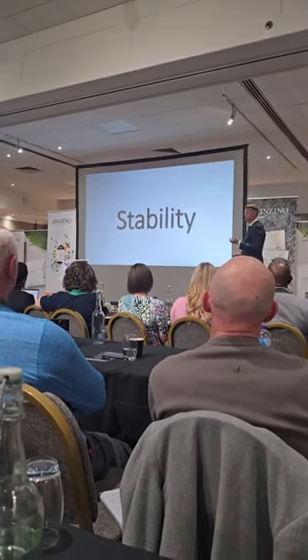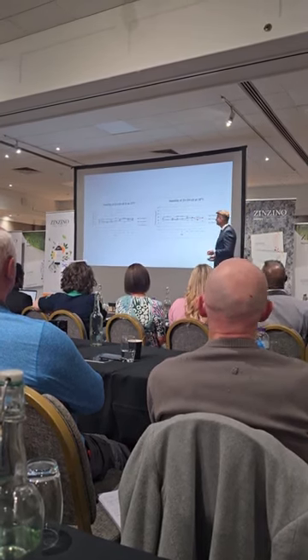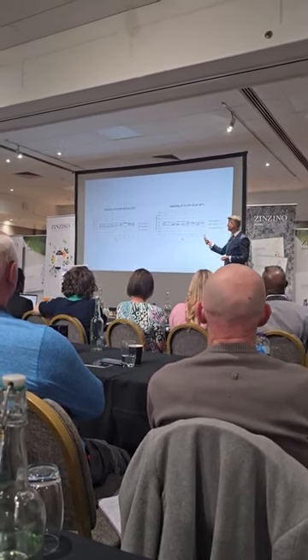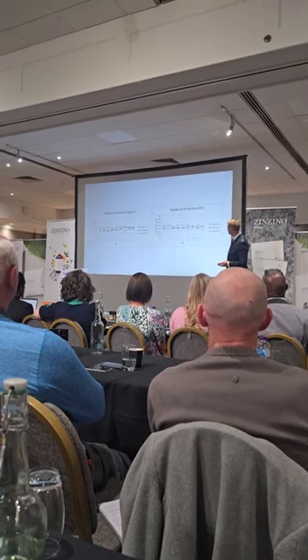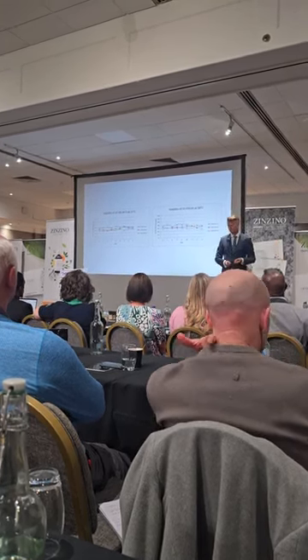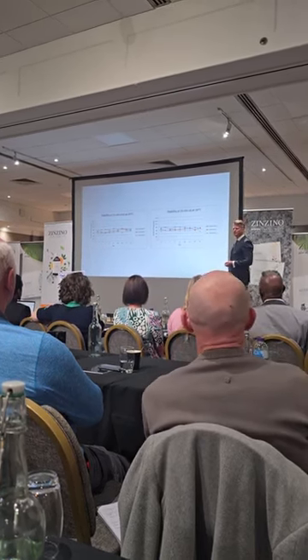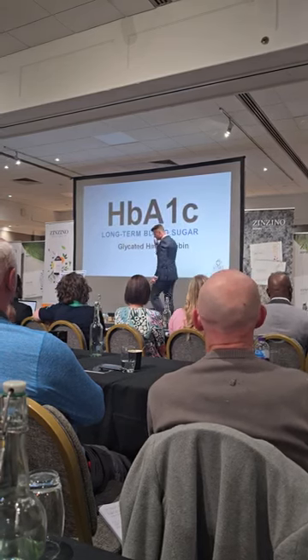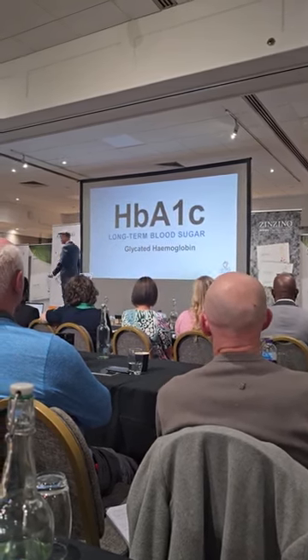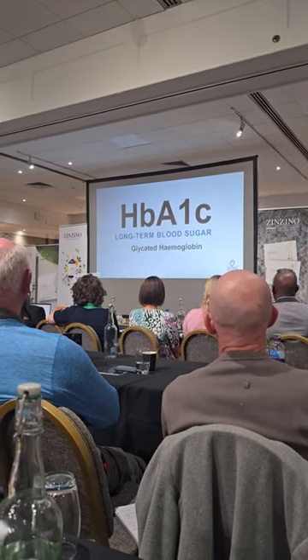Another important thing when you send samples through the mail is stability. These are studies that we do on stability. You can see 3 people over 21 days at 25 degrees and 50 degrees Celsius, and you can see there is hardly any change over time in these 21 days.